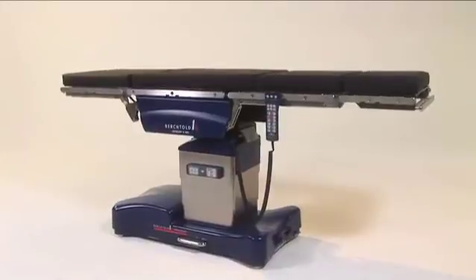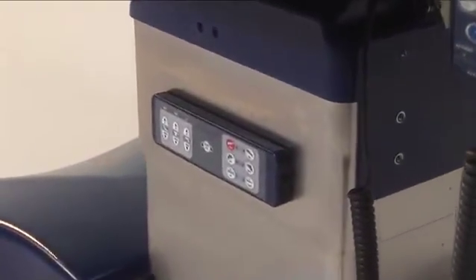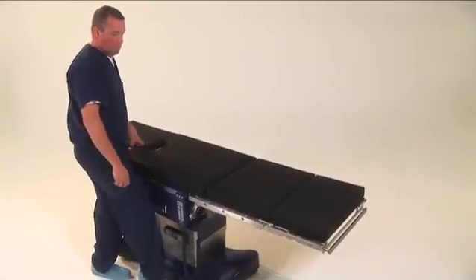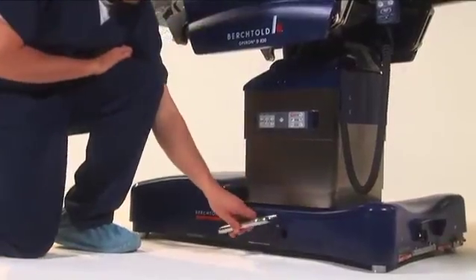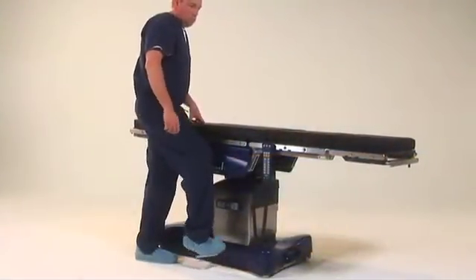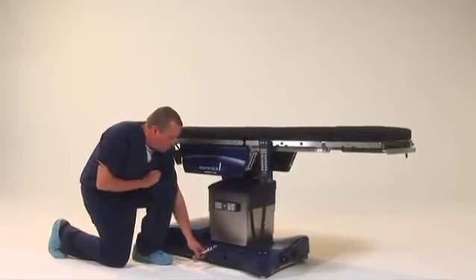Your D820 surgical table includes two hand pendants. One is the primary hand control, and a backup hand control is mounted to the column. In the event the primary hand pendant is lost or damaged, the table can be operated using the backup pendant in conjunction with the manual hydraulic system. To activate the manual system, pull out the manual foot pump lever. This deactivates the primary hand control. A light will appear to indicate the auxiliary pendant is powered. The table is now in manual mode and is operated by hydraulics rather than power. Please note that only the functions available in manual mode will be backlit.